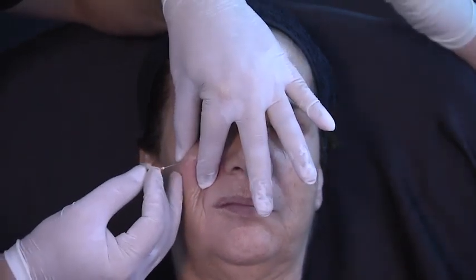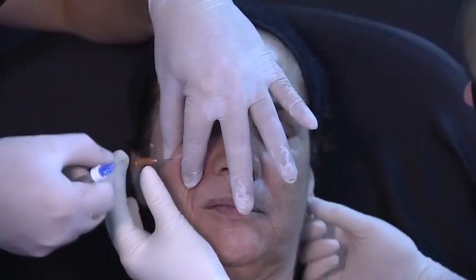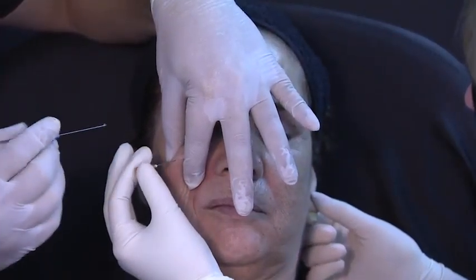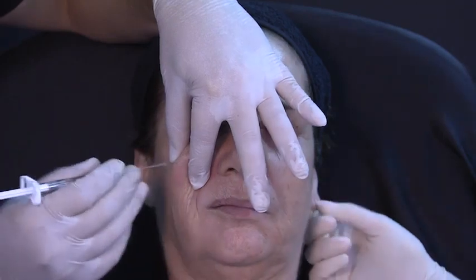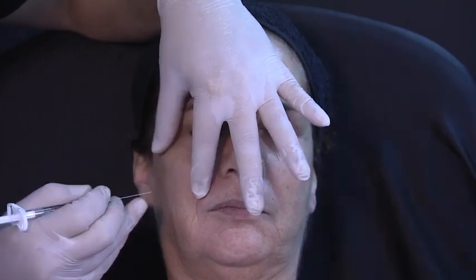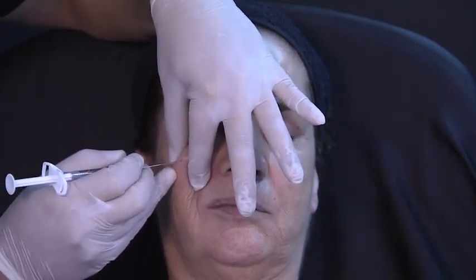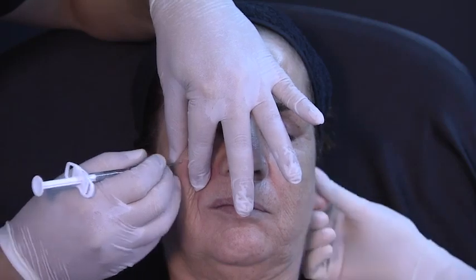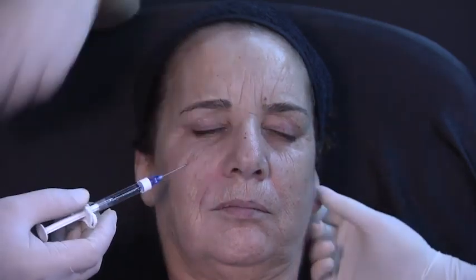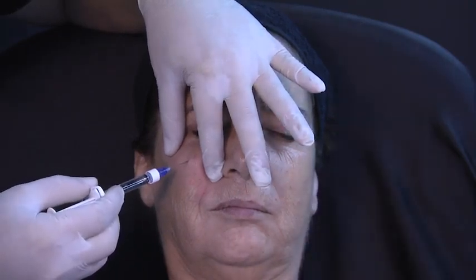I don't know what you're doing, but right. So entry point, pinch the skin. Always pinch the skin. And only enter with a little bit of the needle. I don't need to do all the tunneling and everything, because if not, I have more chance to bruise. Hold like a dart. Wait for the bleeding, which she doesn't. Okay, there it is. Easy.